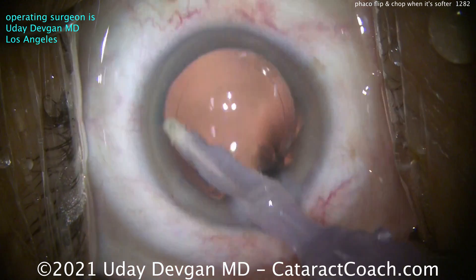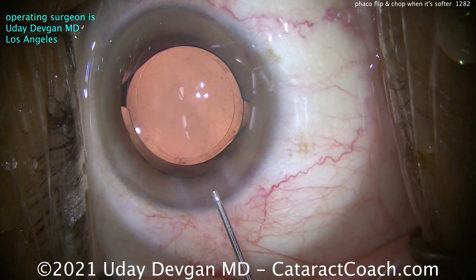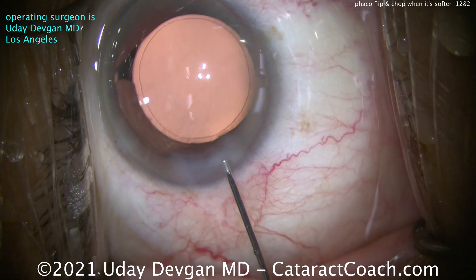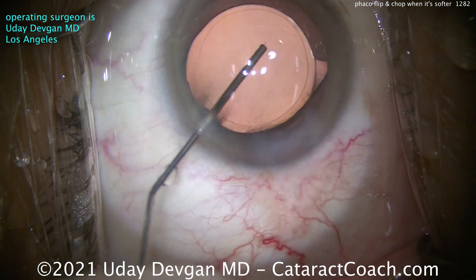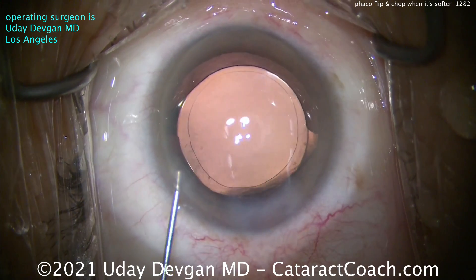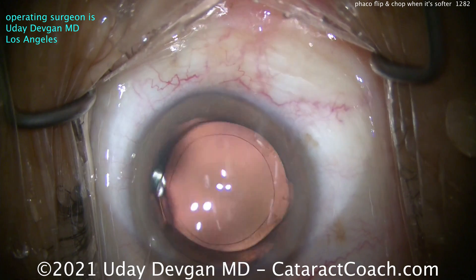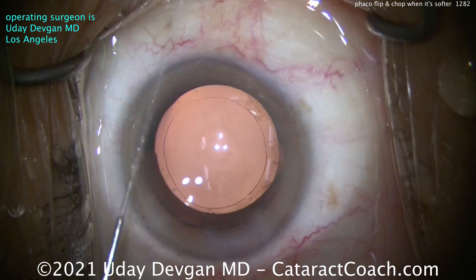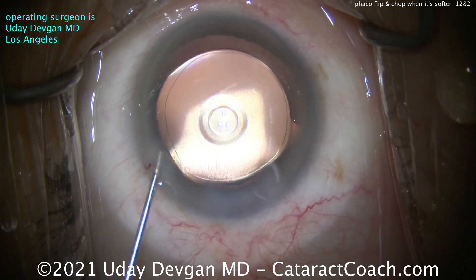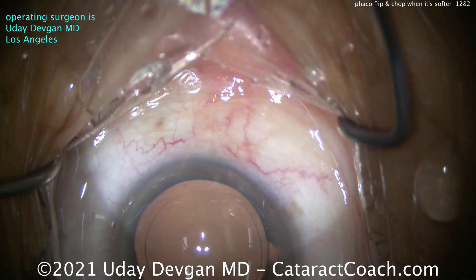That looks pretty darn good. Let's seal up the incisions — this is another one of our complete cataract cases, whole case start to finish, unedited. It's not about speed anymore. Looking at my old videos from 15 years ago, I was very concerned with getting the case done in 3 or 4 minutes — that doesn't make any sense. If it's my eye, spend an extra minute or two and make it as perfect as possible. My goal now is perfection: how beautiful can I make that incision? Look at that rhexis — I'll take that. And the centration of the lens — bang, perfect. These little details are far more important to me now. Especially if you're operating on my eye, spend as much time as you want to make it as perfect as you can.